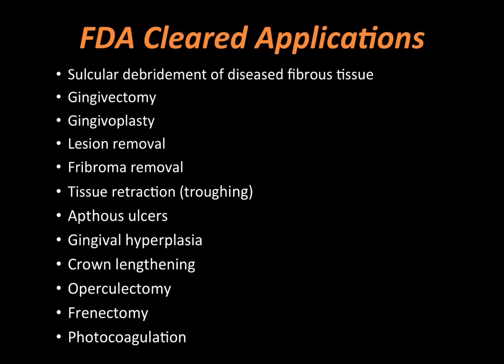So let's look at the applications in dentistry. We can use this dental laser, and it has FDA clearance for sulcular debridement of diseased fibrous tissue. As I mentioned, my hygienists, Stephanie and Dana, love this instrument. They can break down calculus subgingivally, but also decontaminate sulcular areas. I use it for gingivectomies and gingivoplasties. I'll remove lesions, small lesions that we find, fibromas.